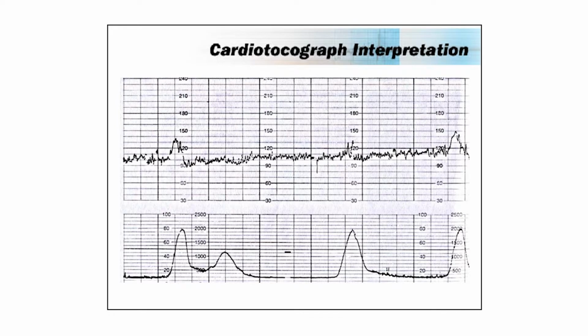So that's the sleep type pattern here. Can you see that? Yeah. Baby's just gone to sleep. So we would suggest that in those types of tracings we shouldn't be leaving that go for longer than 40 minutes. And we should be intervening very simply. Abdominal examination, change of maternal position, out of bed, reattached to the monitor, perhaps a vaginal examination to see can you provoke a response through digital scalp stimulation.